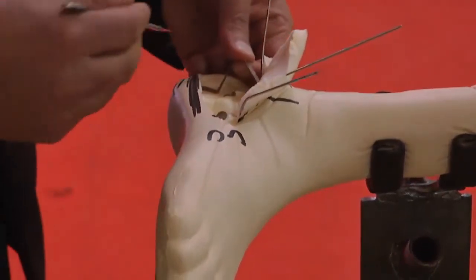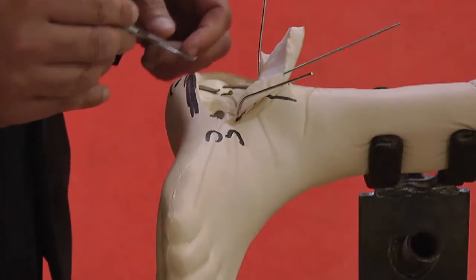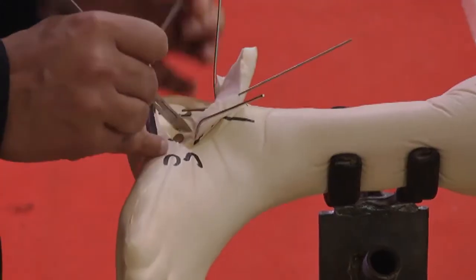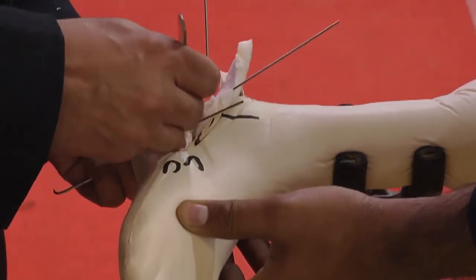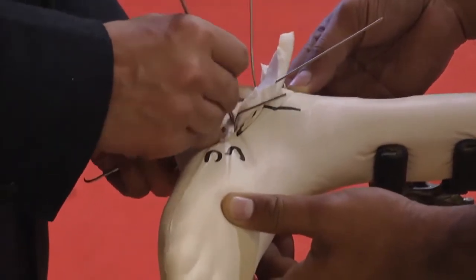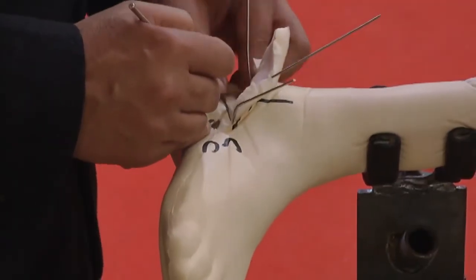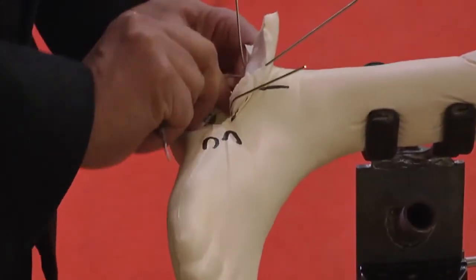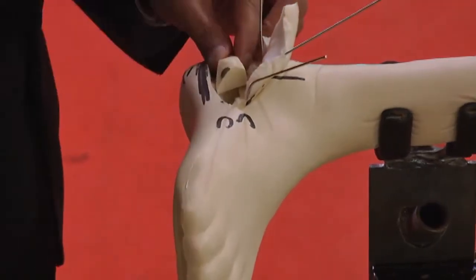I'm going to take out these structures which are here in the bone model, meant only to hold the bone fragments in place. We don't have a forceps, so I'm going to just cut off these tags of tissue which are here just to hold the bone model. The anatomy generally is that there is a lateral wall blowout, which means the lateral wall of the calcaneus is actually a separate fragment, this one. So here the fragments are very well in place, very nice to fix them. But in real situations, you have everything impacted and displaced. So the lateral wall is here. The lateral wall is burst out and lying lateral.